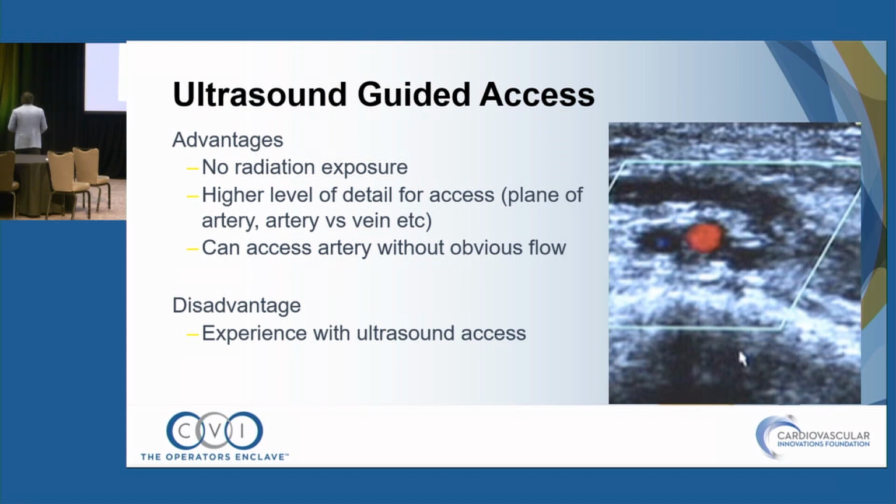So, ultrasound guided access. It's really, really important to learn this. And there are some nuances to pedal access when you're early on learning it, and hopefully I'll be able to impart a little bit of the knowledge I've gained from my experience, with tips and tricks.